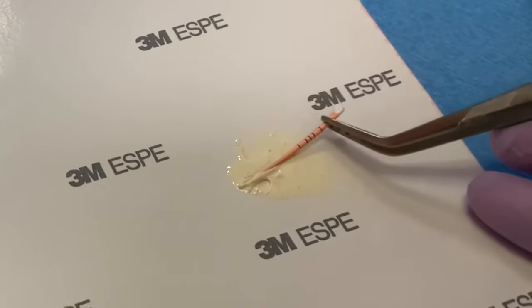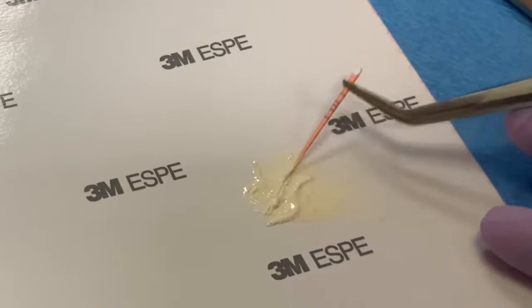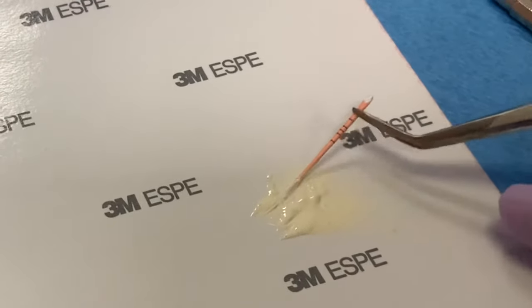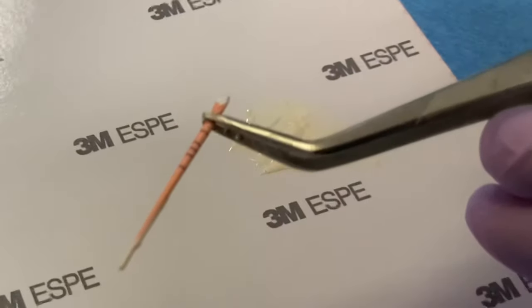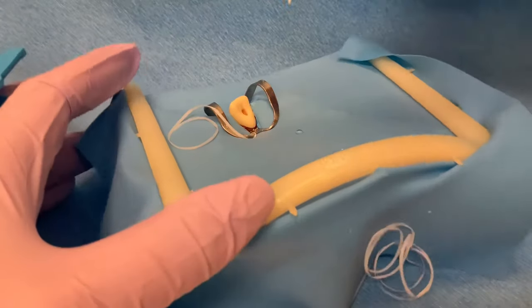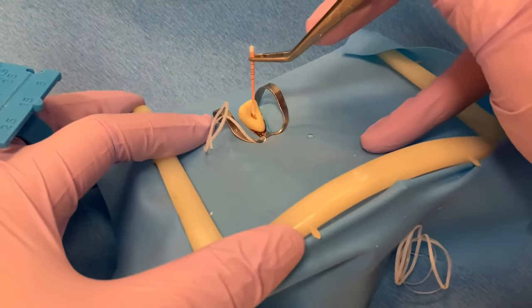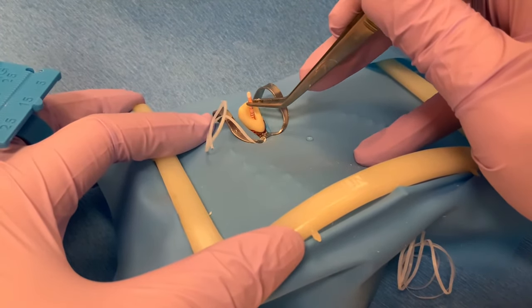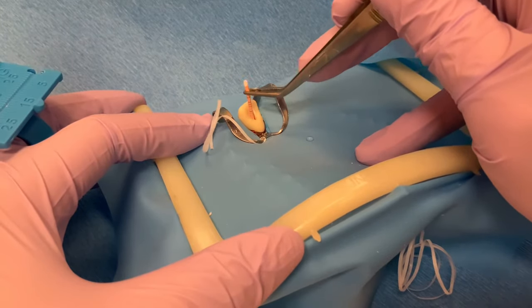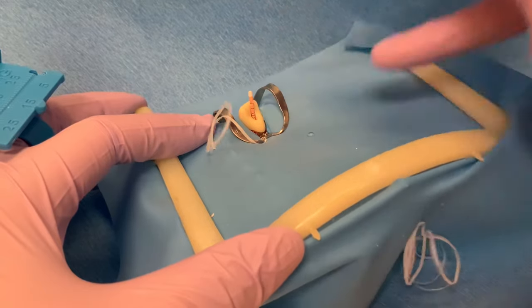Now coat the apical half of the cone with sealer. Place the master cone into the canal, pumping it up and down a few times slowly in order to coat the canal walls with sealer. Verify again that the cone goes to working length and has tug back.